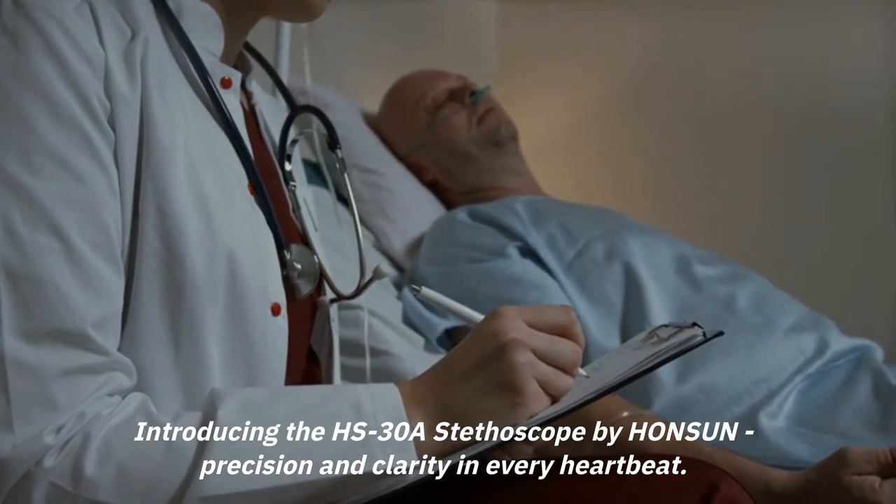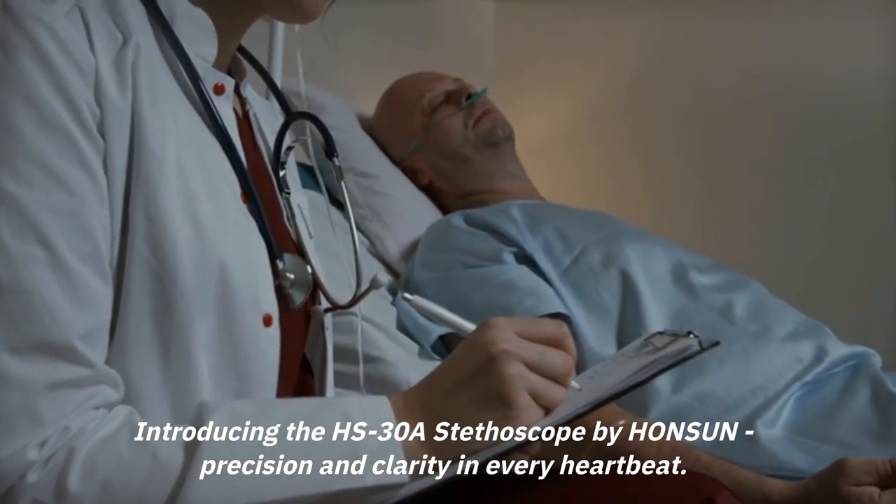Introducing the HS30A stethoscope by HONSUN, precision and clarity in every heartbeat.